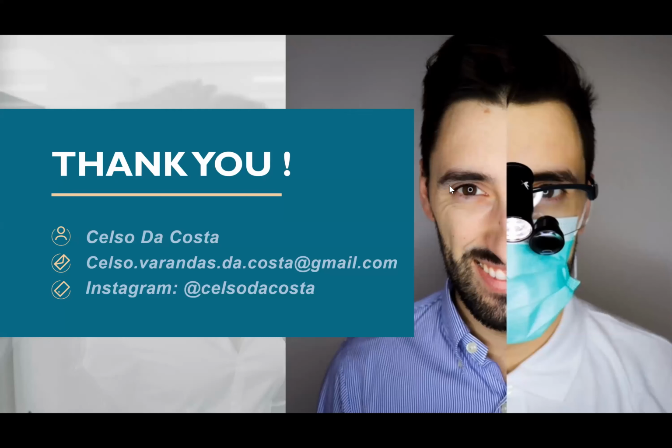With the CLICK, every time I use it, I get 2 to 3 shades lighter. In one of the cases where I used home bleaching, like you said, I got 1 shade lighter. So in this case it's not the best solution, because the patient wants 3 to 4 shades lighter. So that's why I'm using the home kit with this kind of patient, as the question was about combination treatments with CLICK and home products.